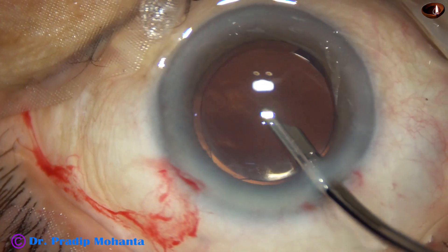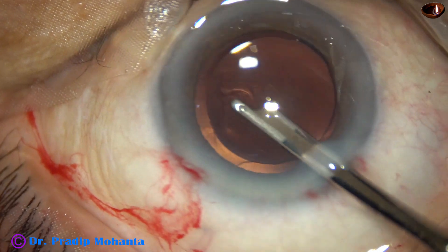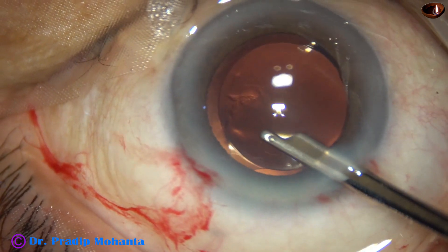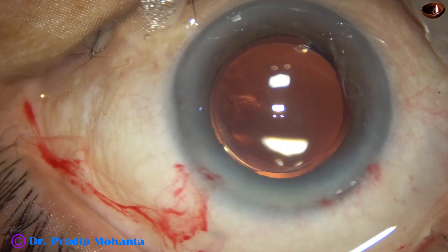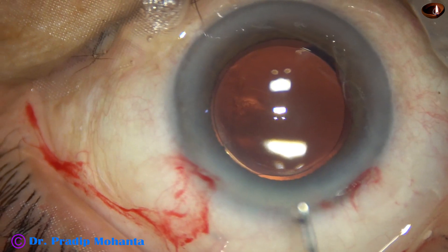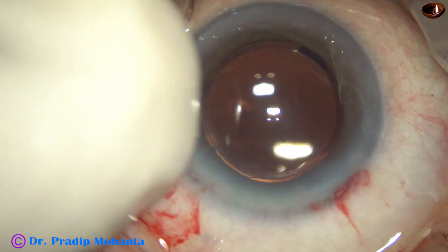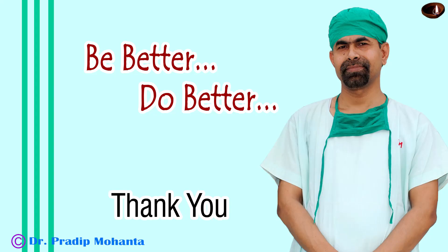No, there is no vitreous strands. I confirmed using Kenalog that there is no vitreous strands in the anterior chamber. Visco is injected through the side port to conclude the case. Thank you very much for your attention — hope this video will help you in managing such cases in your practice.